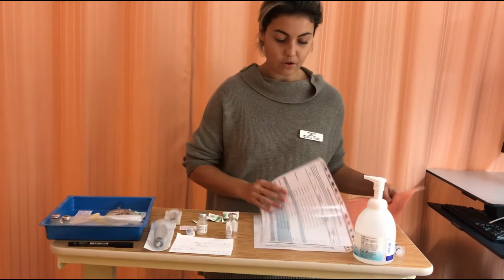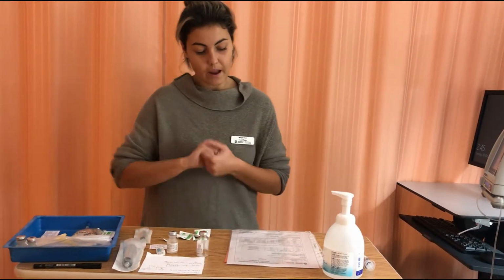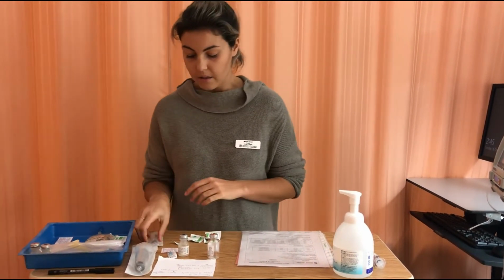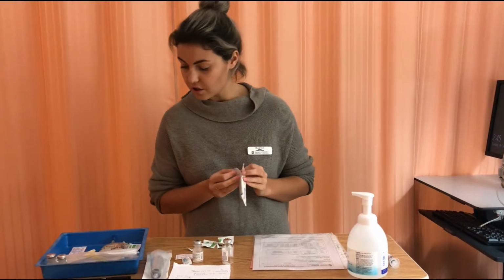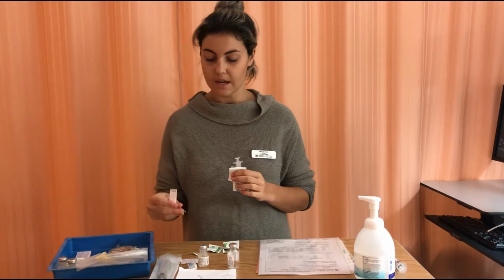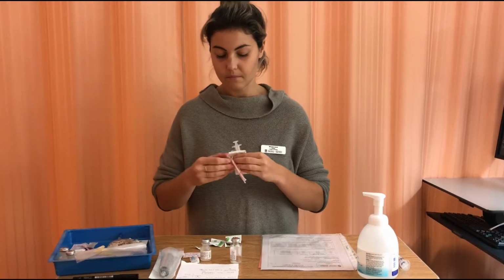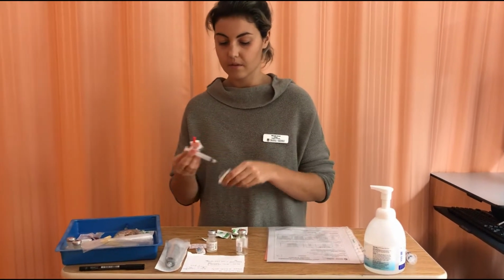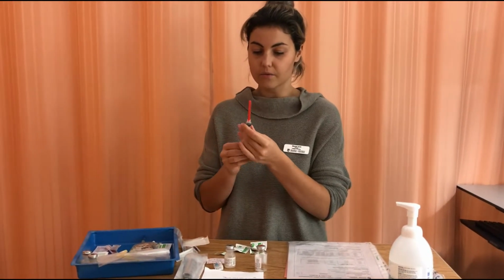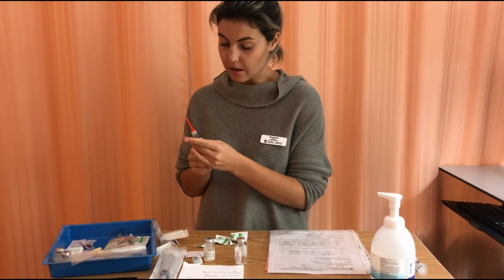Alright, so according to my drug monograph, again, it's 3.1 mLs of sterile water that I will be diluting the concentration with. So I'm just going to wing the package so that I maintain sterility. And just fill my syringe with the air that I need to use to displace the pressure.